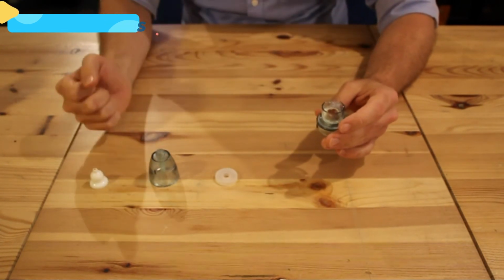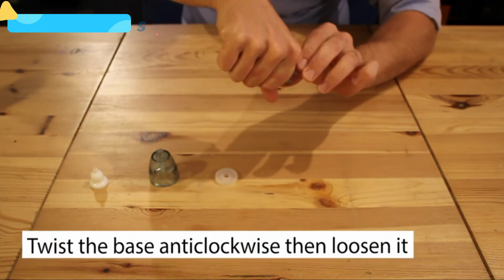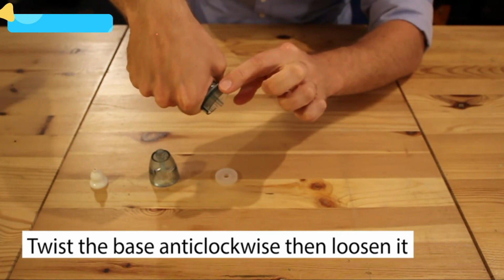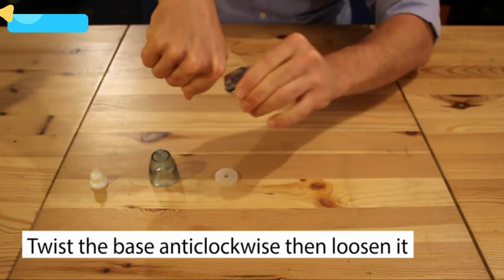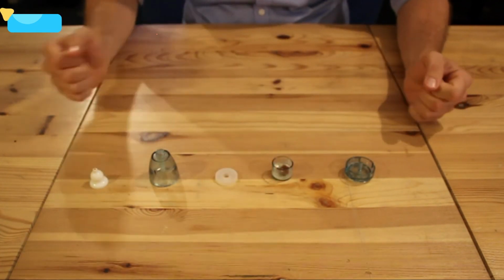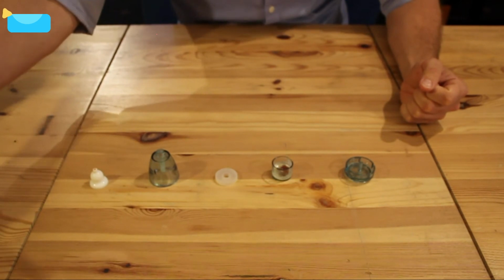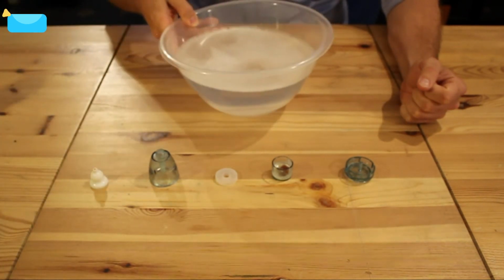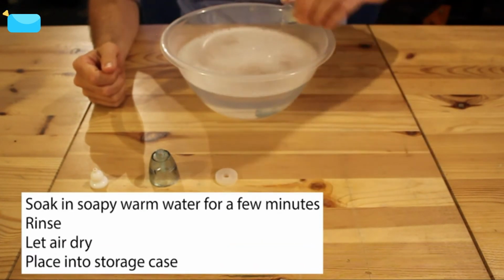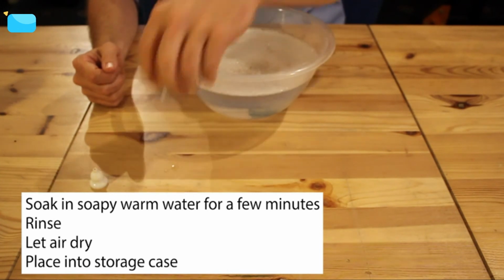So here you're going to need to install two AA batteries. Here we are, ready to use the device. The first thing you need to do is choose the nozzle you want and attach it to the storage tank just by pushing it on.